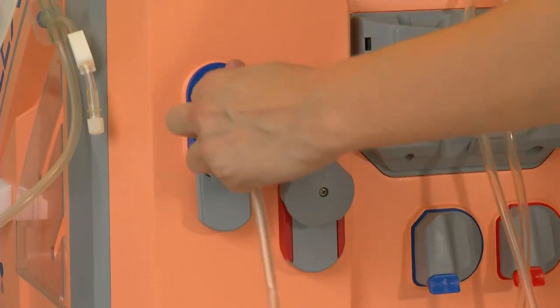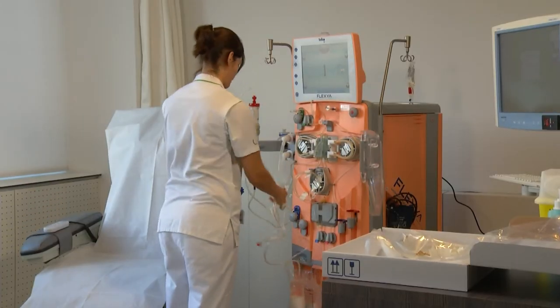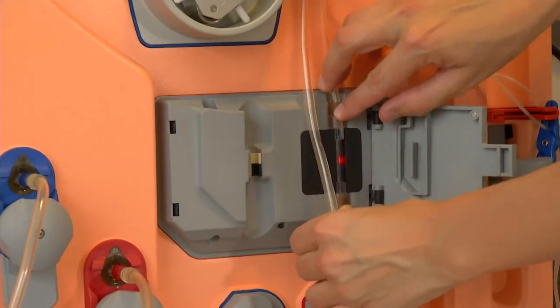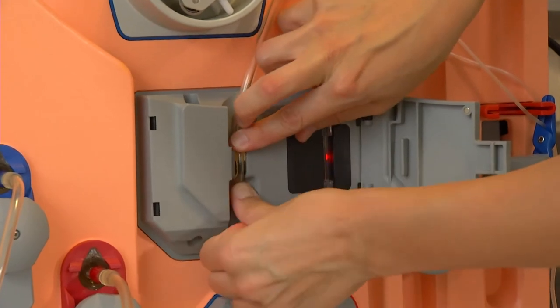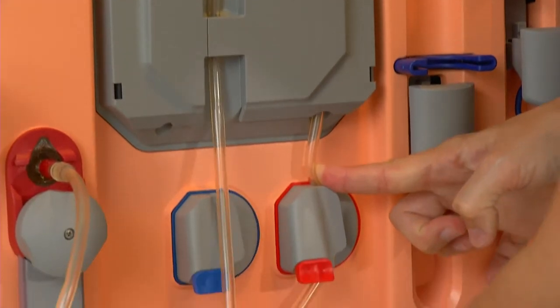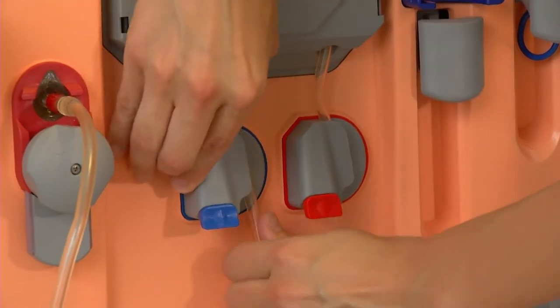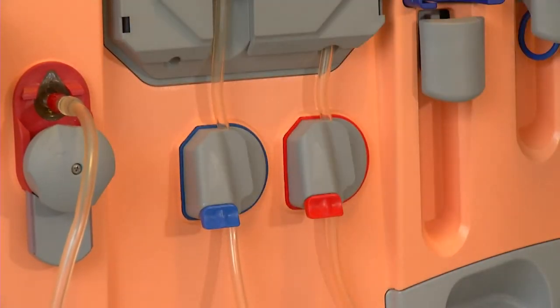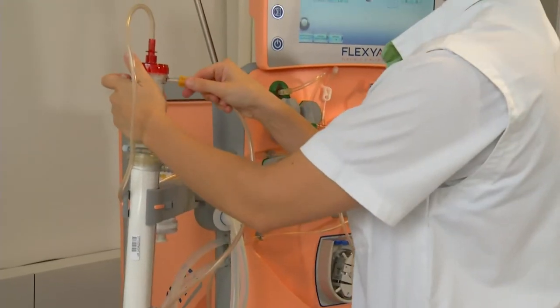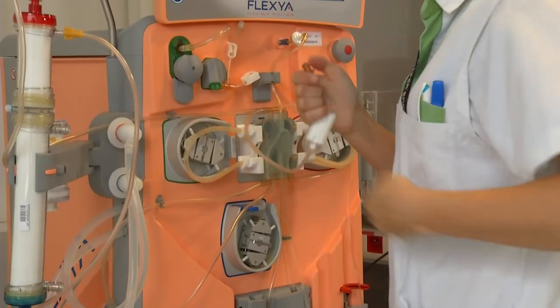The venous and arterial blood lines are connected to the blue and the red flushing port, and then both lines go through the sensor block. This sensor block measures the blood volume in the arterial line, whereas the blue line passes through yet another air detection system. When the system detects air, a clamp will close the line to the patient and the safety is guaranteed. The connection of the infusion line is done in the convective part of the dialyzer. This will generate the infusion flow of the ultrafiltrate and forward it to the sorbent cartridge.